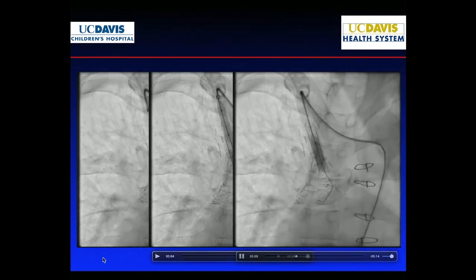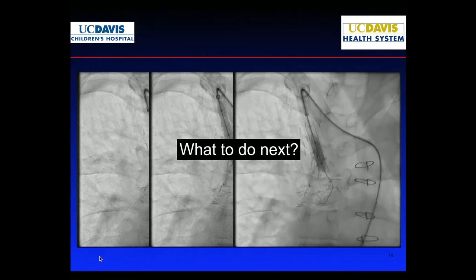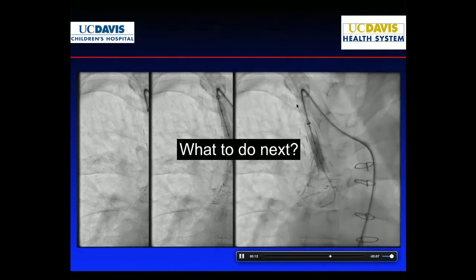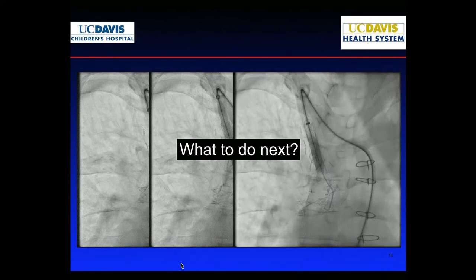stented BT shunt. So at this point in time, this is 4 hours into the case, we cannot get the sheath in place deep in there to be able to advance another stent. So the question is, what do you do next at this point? I don't know if now's a good time to get some comments, but I know we have a shorter time, so I'm going to keep moving, okay?